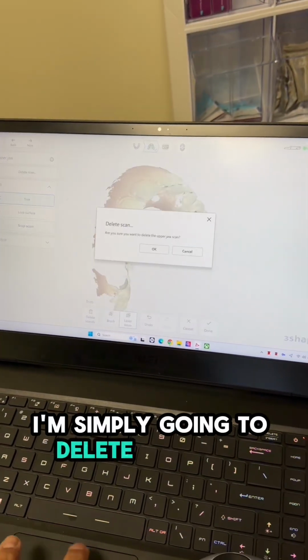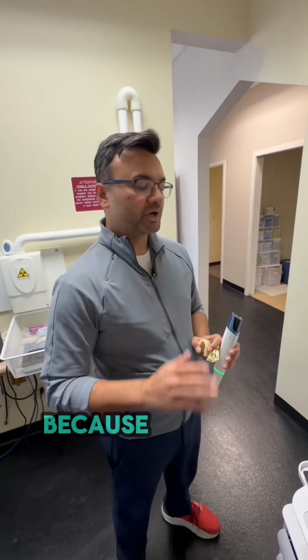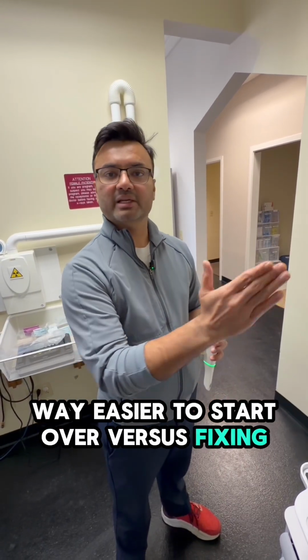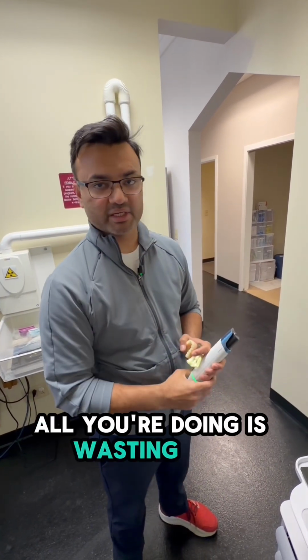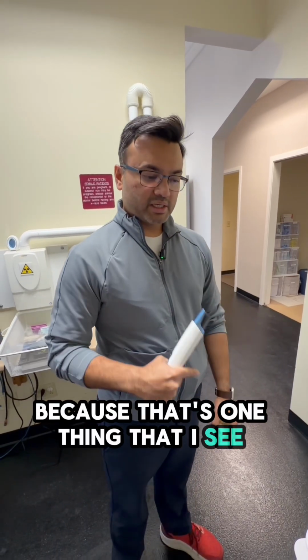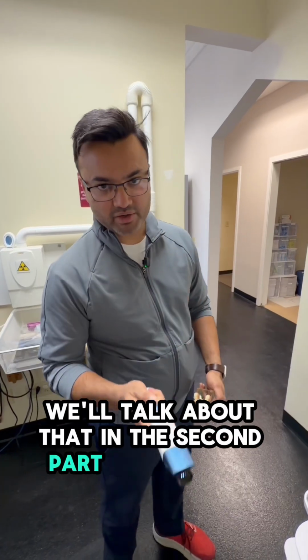I'm simply going to delete this scan. The moment I see a double image in my scan, I start over, because it's way faster, way easier to start over versus fixing a bad scan. All you're doing is wasting time. We'll also talk about how to position the patient, because that's one thing that I see again done very, very wrong. We'll talk about that in the second part of the video.